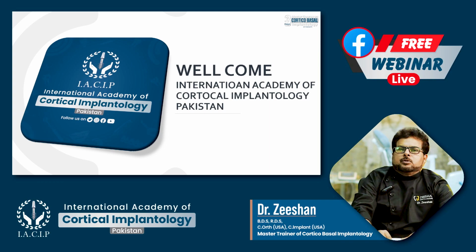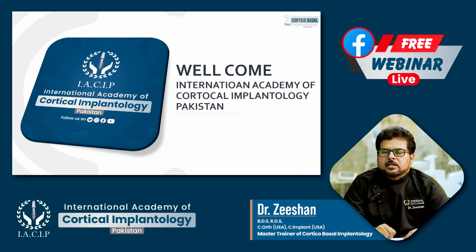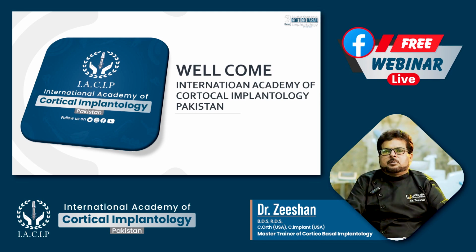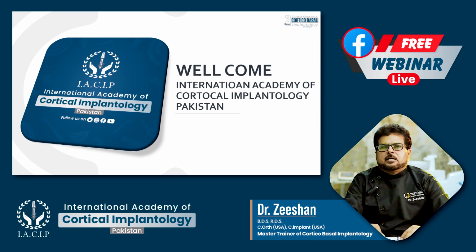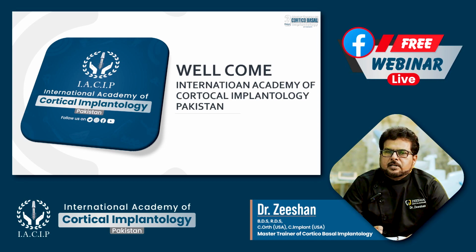First was to fix them in the basal bone. Second is to increase the bone and implant contact. Third is the bending. These are a few factors which are possible with basal implants, as they are isoelastic, so we can bend them. Bending their abutment, we can increase the anchorage, and in turn we will achieve higher primary stability.